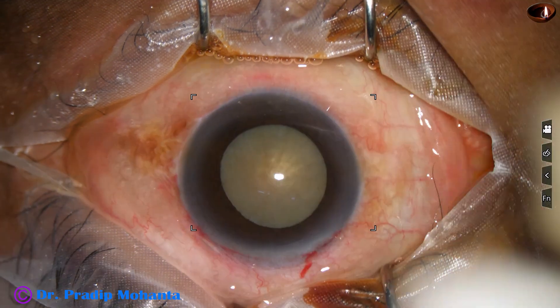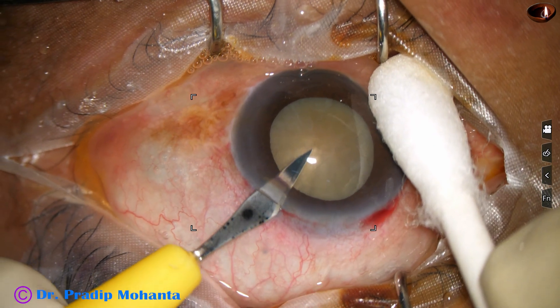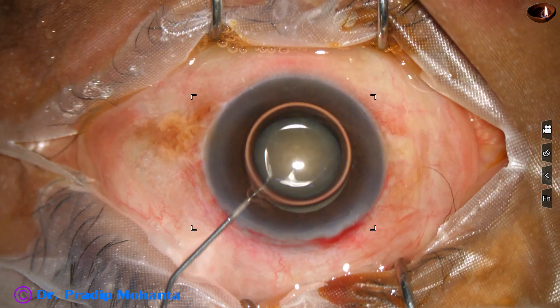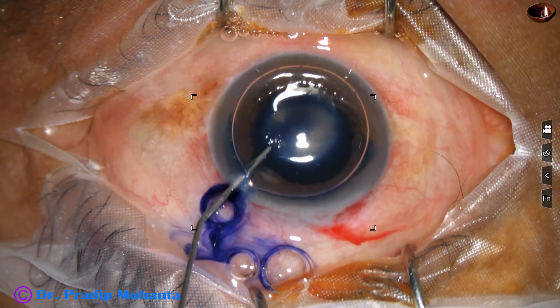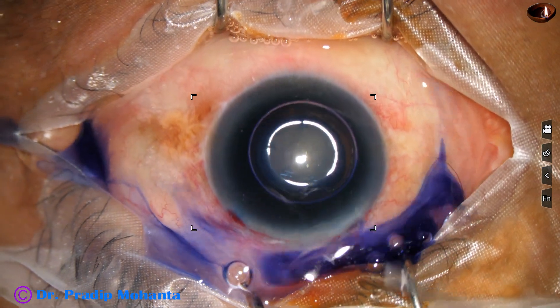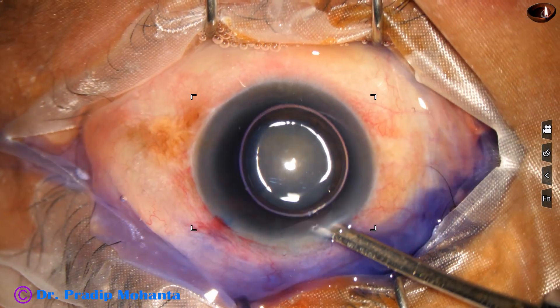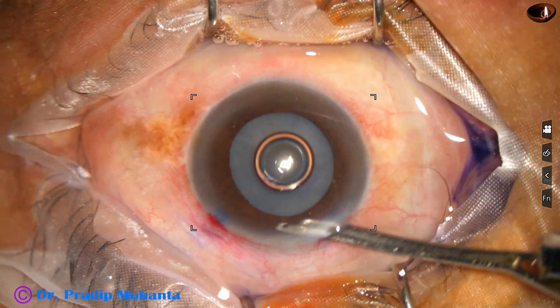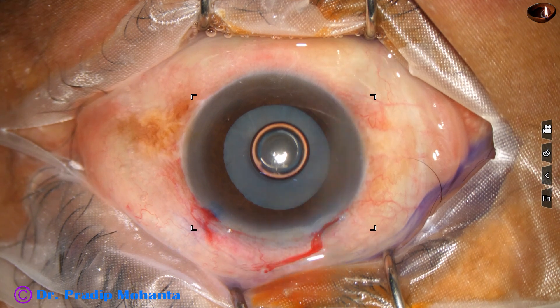The main incision is placed and now this is a side port on the left side of the main incision. An air bubble is injected. Trypan blue dye goes and stains the anterior capsule. Adrenaline is used to keep the pupil dilated. The dye is washed out and now two percent hydroxypropyl methyl cellulose is injected into the anterior chamber.